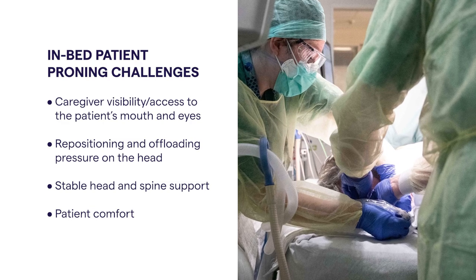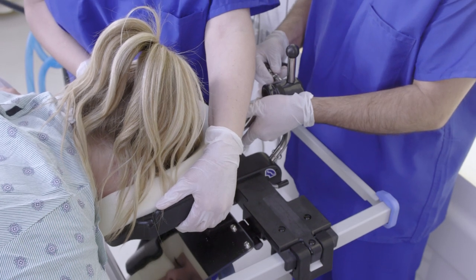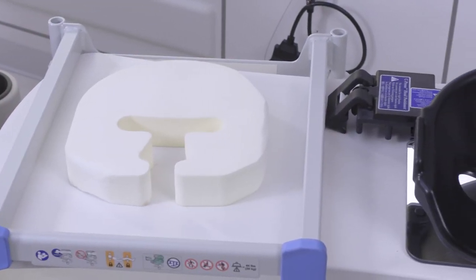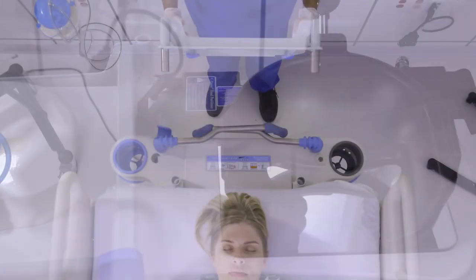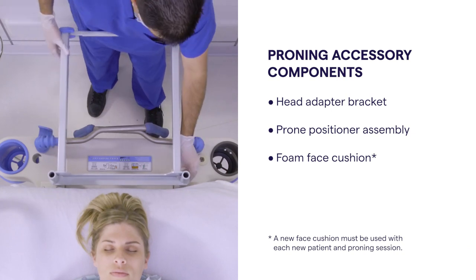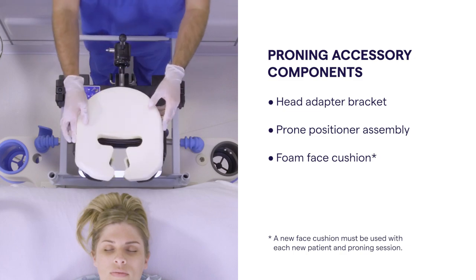Especially when proning for an extended period of time. The proning accessory assists in overcoming these challenges with three components that can be easily installed onto the Hill-ROM Progresa smart bed by two caregivers. These components are the head adapter bracket, the prone positioner assembly, and the foam face cushion.